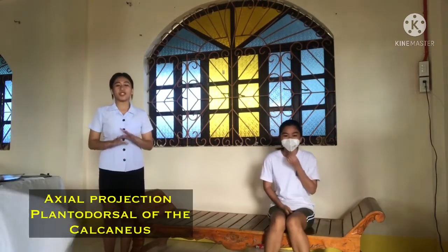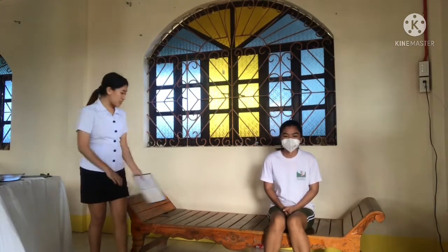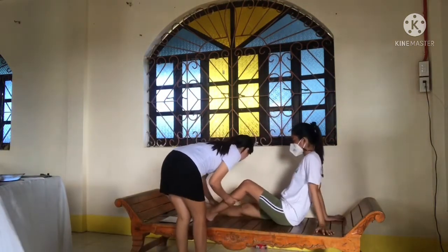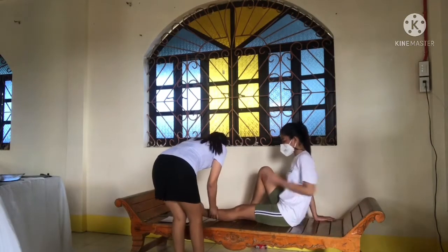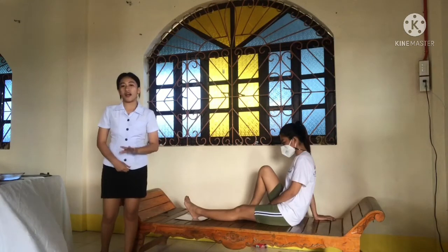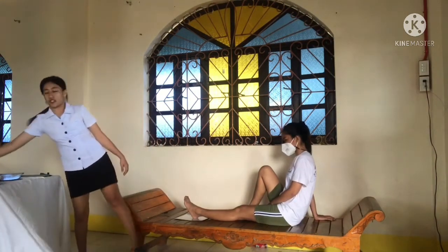Next is the axial projection plantodorsal of the calcaneus. So, the IR used must be 8 by 10 inches. So, place the patient in seated position with the legs fully extended. So, place the IR under the patient's ankle, center to the midline of the ankle. Have the patient grasp the gauze to hold the ankle in the right angle dorsiflexion.